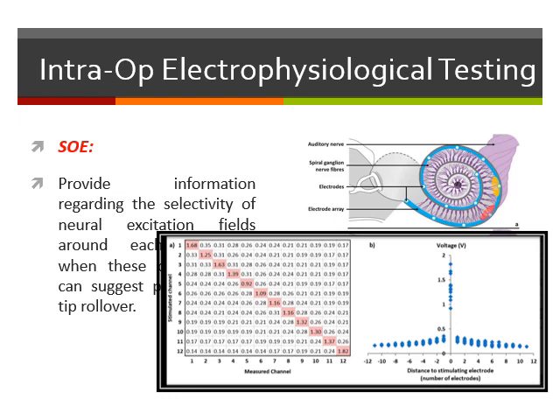I can expect that there is some sort of fold over or misplacement of the electrode that makes these two electrodes in relation or in contact to each other much more than in normal conditions. And this is the idea about the spread of excitation.